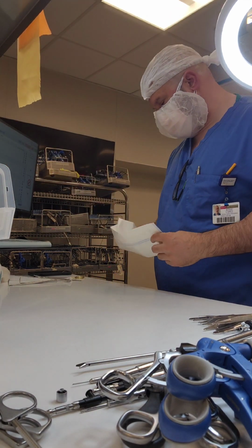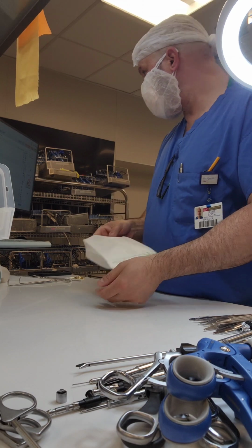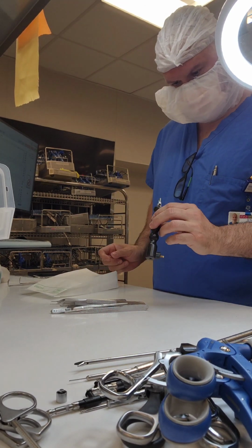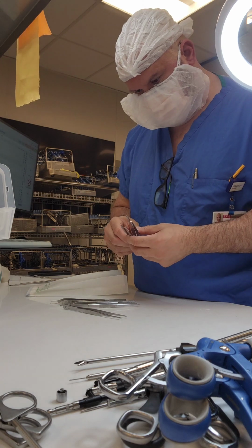Actually, I'm not there yet. I'm actually going to do my scissors. Apologize. So we put our not scissors, I'm going to do my forceps. So we put our forceps in the craft style bag. So I placed an indicator in there. All right, I put that little spatula handle there.